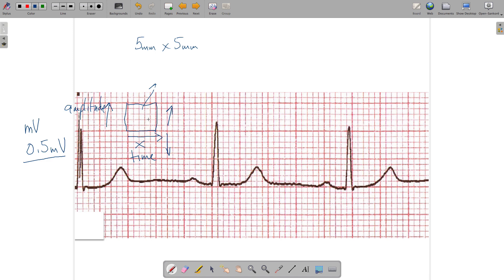In terms of time, each big box is 5 millimeters across by 5 millimeters tall and is comprised of 25 small boxes.